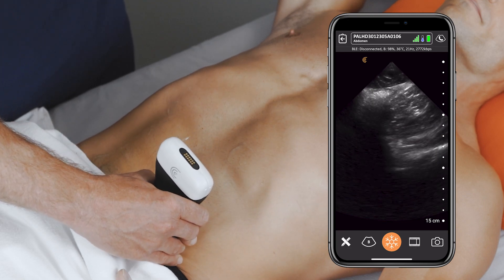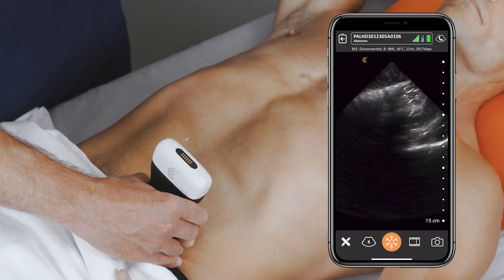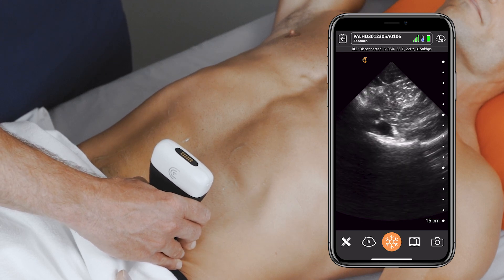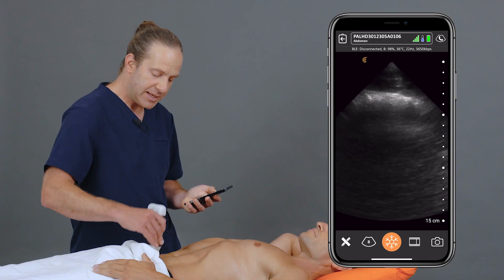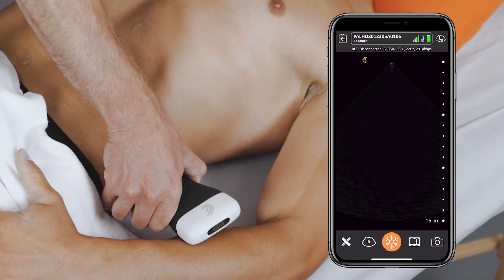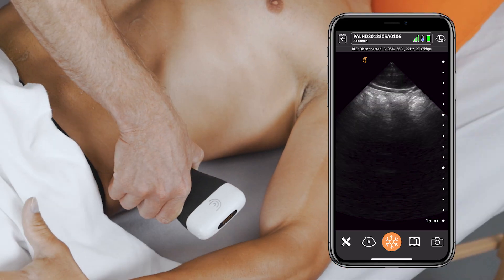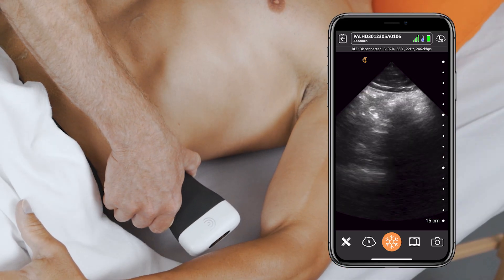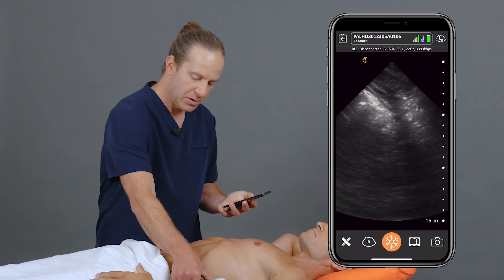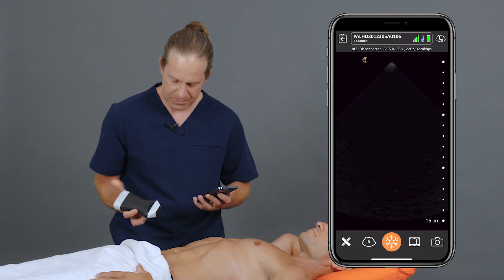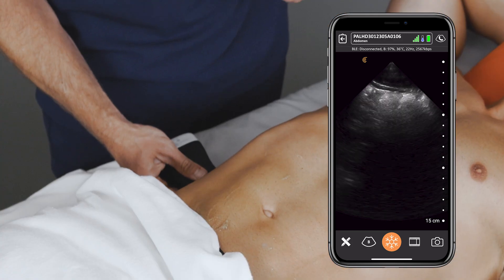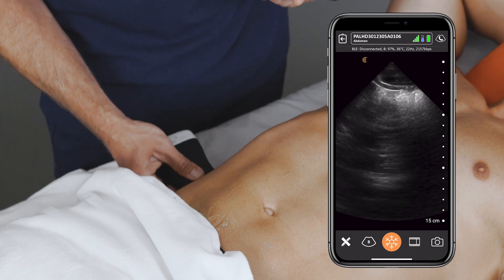All the while, I'm looking for any fluid-filled loops of bowel or signs of decreased peristalsis. Lastly, make sure to check the pericolic gutters, as sometimes fluid-filled loops of bowel can hang out down here. And with that quick scan, I can promptly change my pretest probability of whether or not a bowel obstruction is present.